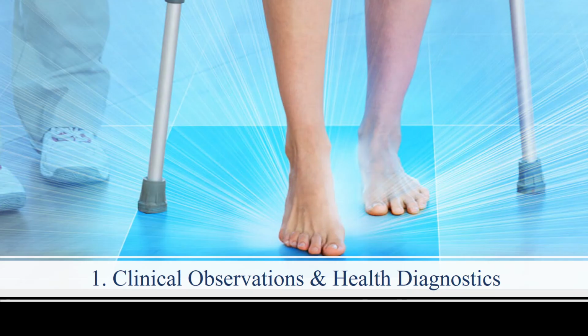First one, clinical observations and health diagnostics. The main focus of clinical assessment is to describe the way in which a person walks. The gait assessment techniques used in clinical assessment vary with the skills and facilities available in the clinic, the nature of clinical condition, and the purpose for which the assessment is conducted.